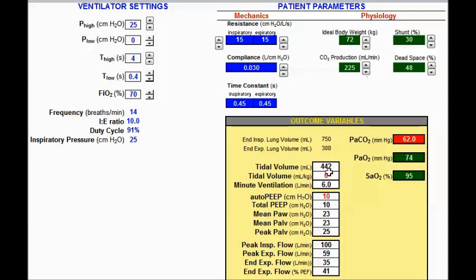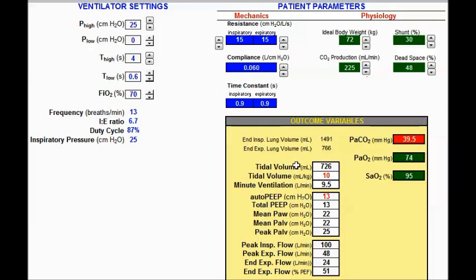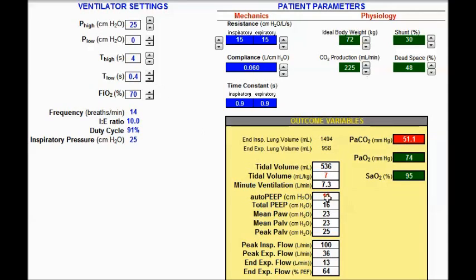I'm trying to maximize tidal volume and minimize auto-PEEP so ventilation is lung protective. Increasing compliance to 60: I now have quite a bit of auto-PEEP at 16 and a tidal volume of 7 — both values are concerning. Increasing t-low actually increases tidal volume, so I'll decrease t-low to target 6 mL/kg. There is still a lot of auto-PEEP at 18. Decreasing t-low further would only create more auto-PEEP. At this point, tidal volume is in the 4 to 6 cc range — that's as low as auto-PEEP can go; going up sacrifices tidal volume safety.